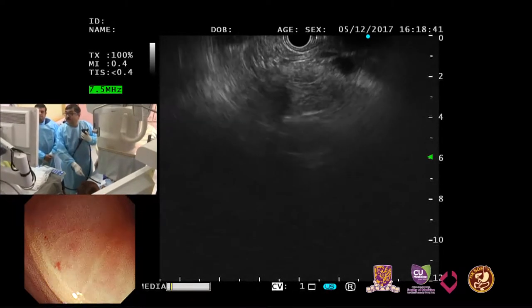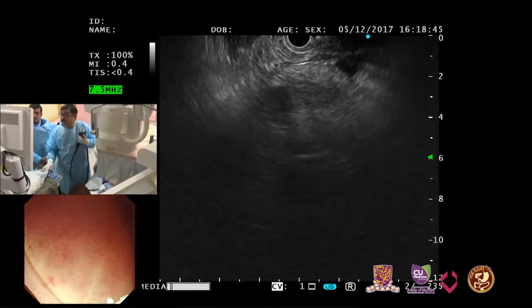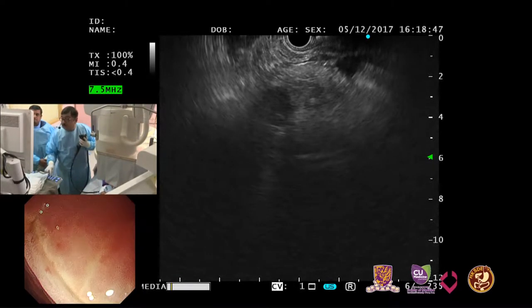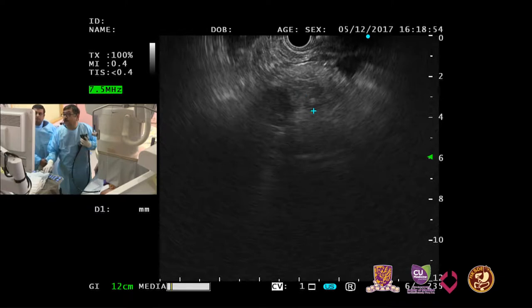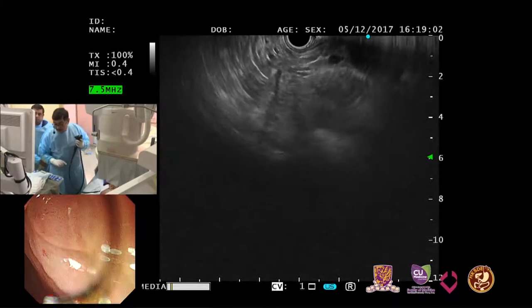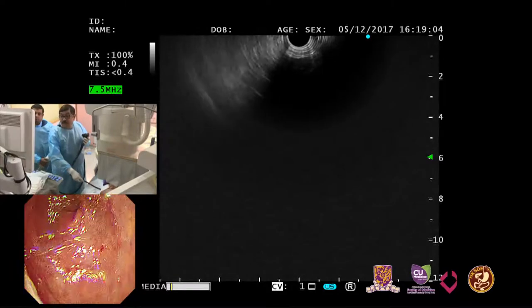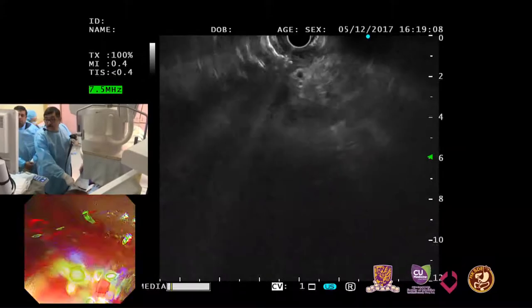And this is the duodenum. See here, freeze. So, the round thing that you are seeing here, this is the duodenum and this is the head of the pancreas. We don't see any mass in the head of the pancreas. We haven't seen any stone anywhere. So all we have seen so far from the stomach is dilated CBD and PD. So I'll quickly go to the duodenum and see what's happening.